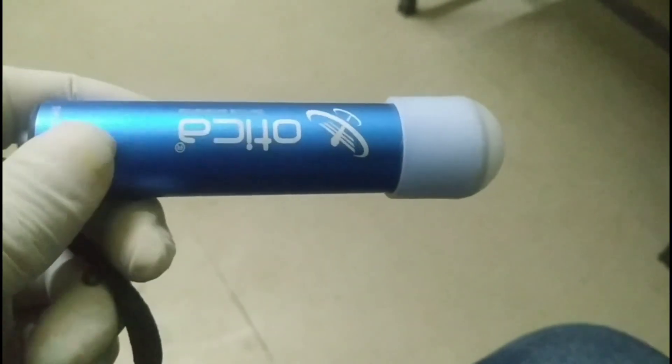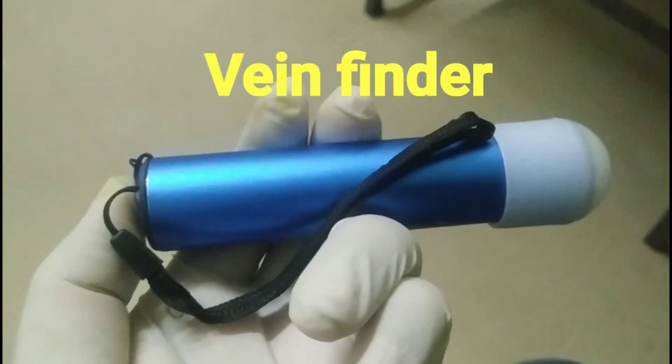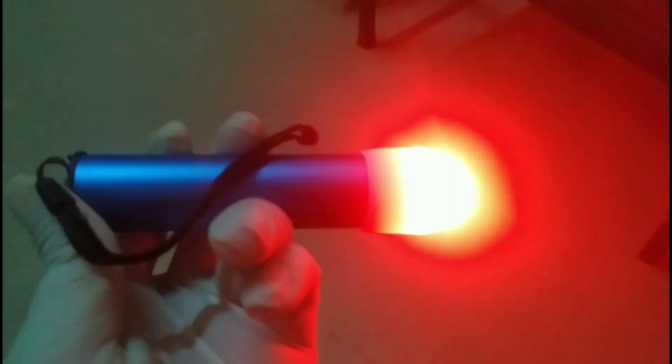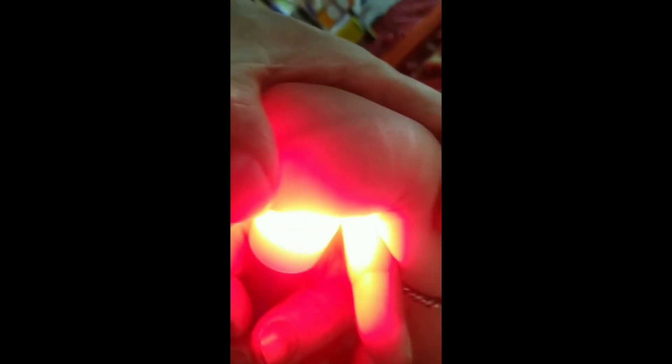Hello guys, welcome back to my YouTube channel. Today's video is about easy vein cannulation using a vein finder somebody has gifted me, and it is named as Otica. This beautiful device called vein finder emits an infrared light which helps to detect the accurate position and direction of a vein.